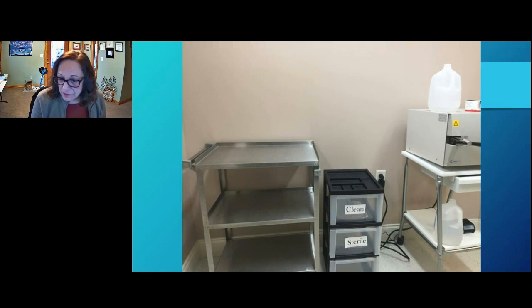The other part of this is the gallons of distilled water. These are, of course, tabletop sterilizers that require frequent filling with distilled water. My concern when I saw this was, I don't know about you, sometimes I'm really butterfingers. I would be concerned that the water could spill.